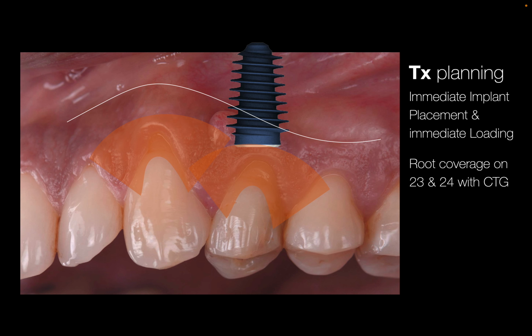I'm going to extract a tooth that has a problem. I'm going to place an implant. I'm going to put a crown on the top of that implant. Obviously, I need a specific primary stability to warranty the stability of my implant during the whole osseointegration process.